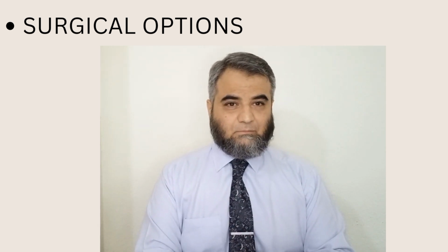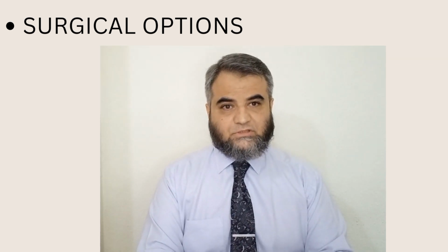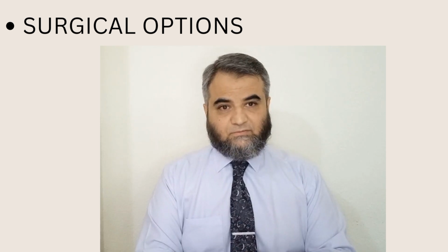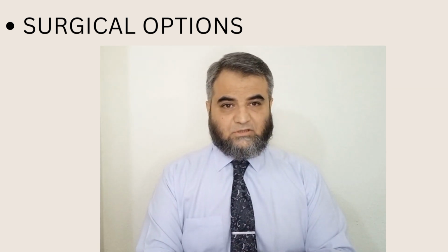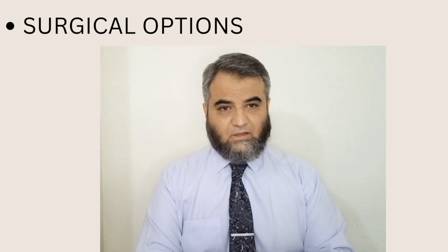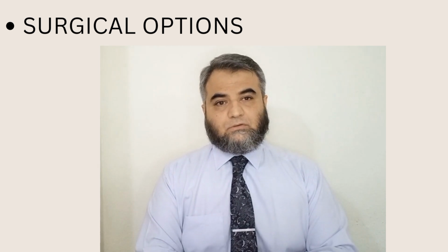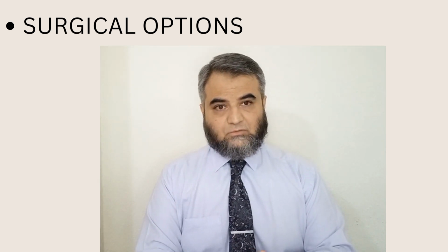All these things can be done depending on the condition and situation and the resources available with the surgeon. If there is a chance of developing a pupillary block, then the surgeon may also consider peripheral iridectomy. So these are the things which can be tried and anticipated.